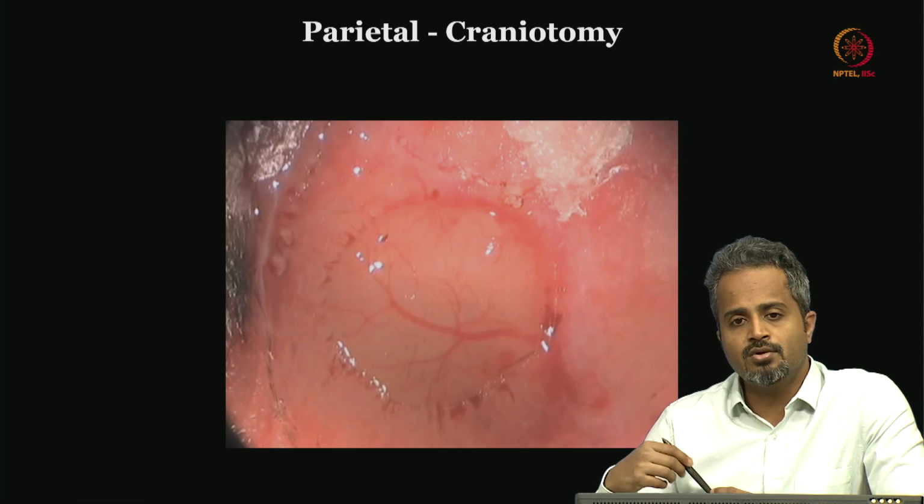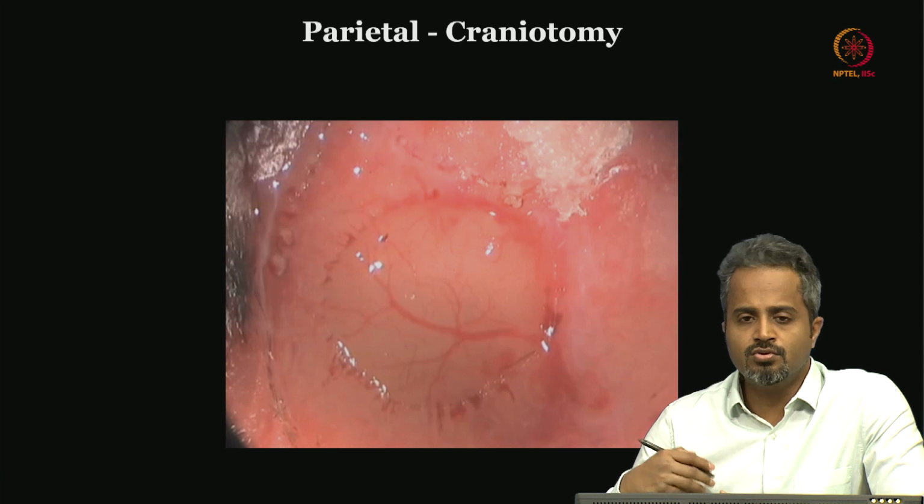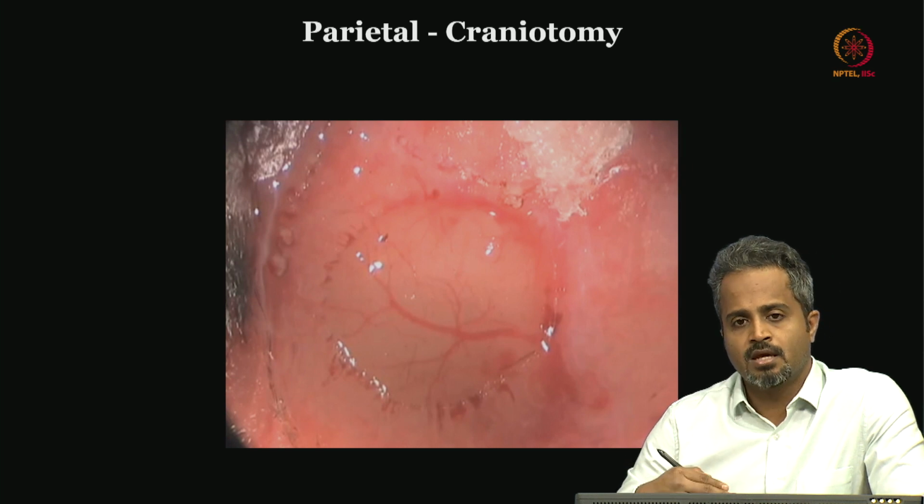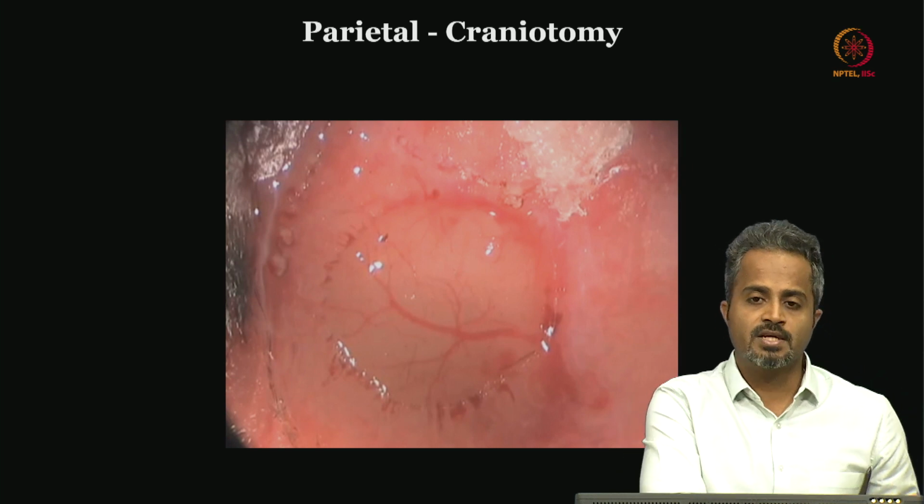So it's very important that you maintain the dura, which is a thick tough layer, but is bound to get injured if you're not careful enough to protect it in the step of drilling. So this is a very critical step.